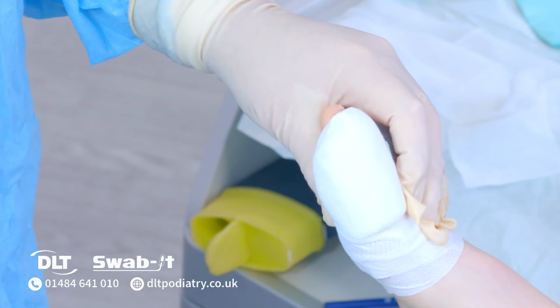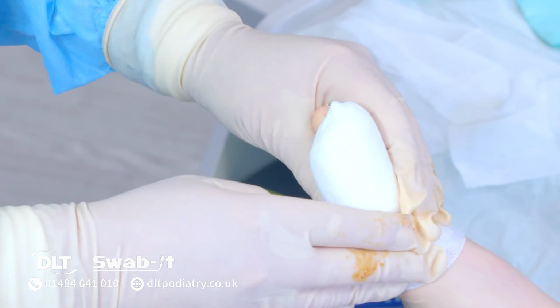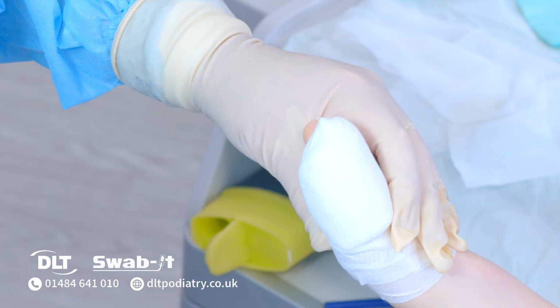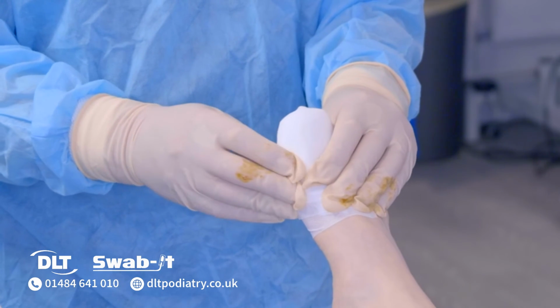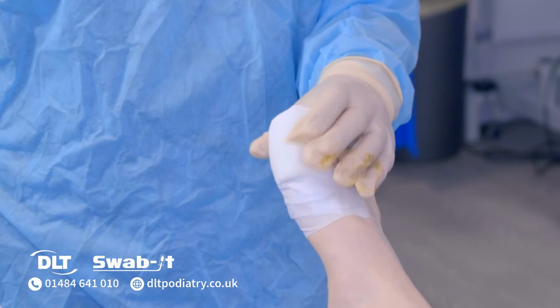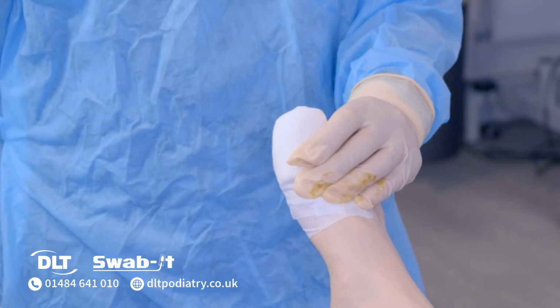So we would advise this patient to get a limbo because he's had a phenolization, so healing will be anything from 6 to 8 weeks as the expected norm. To have it redressed, depending on if there's seepage, within 3 to 5 days. And then either once weekly or twice weekly, depending on the amount of discharge caused by the phenol and what the wound looks like.